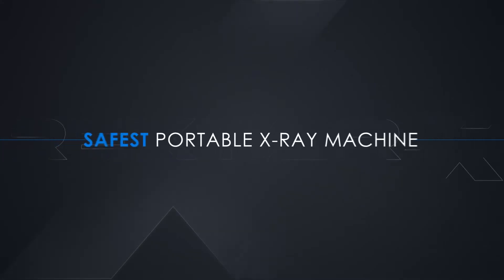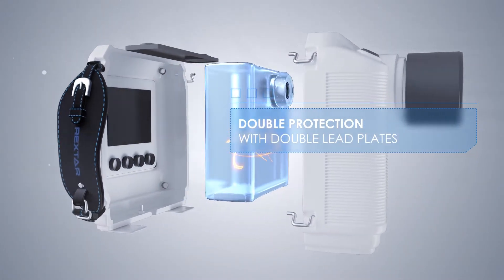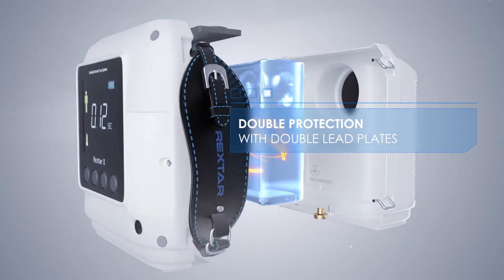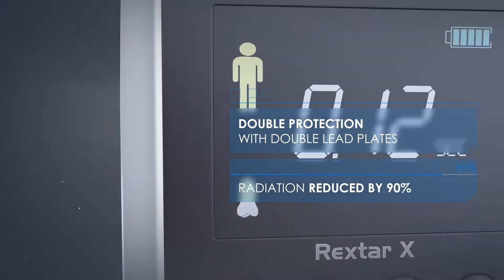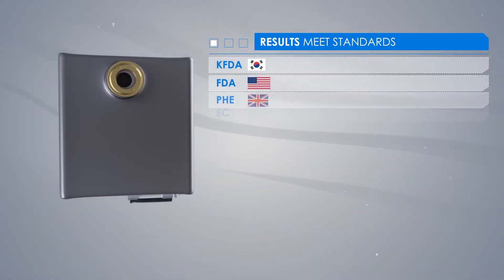Rextar X is the safest portable x-ray machine in the world. It is completely covered with double lead plates that reliably protect the patient and the operator from radiation exposure. This is confirmed by clinical trials of leading international standards.